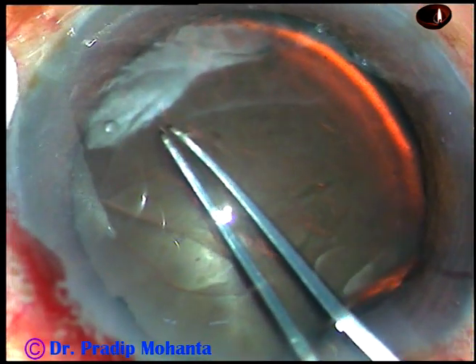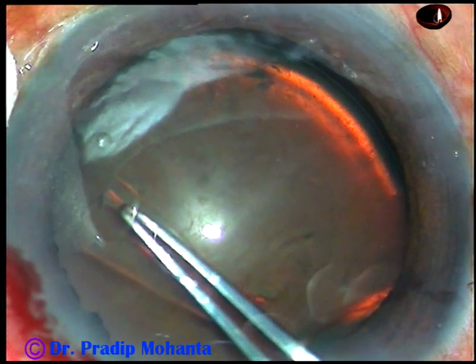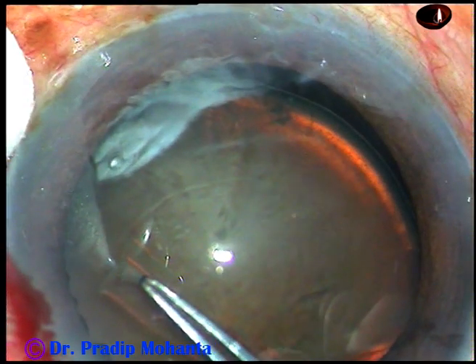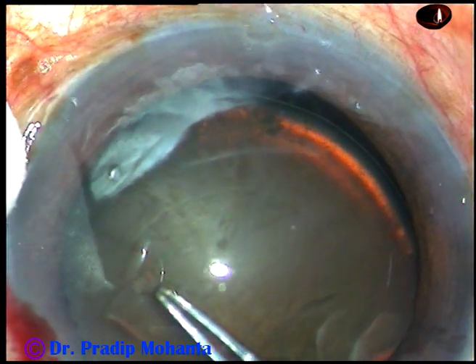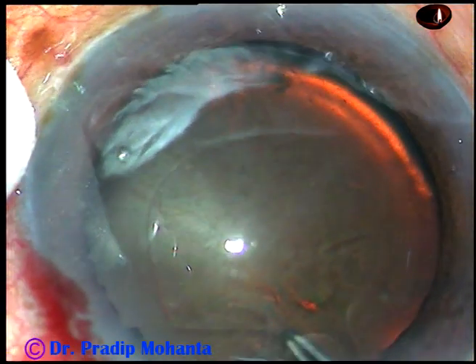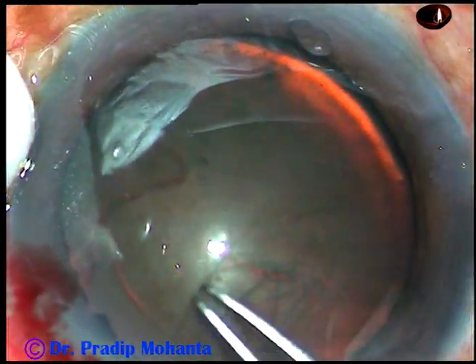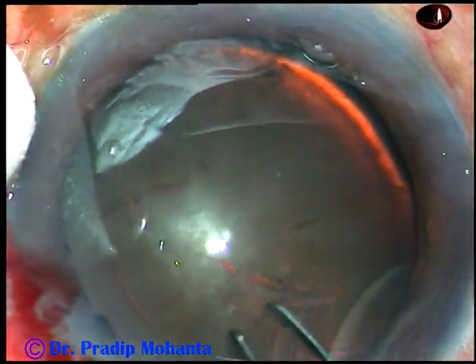In such cases, we should not pull the capsule in a jerky manner. In this view, we can see subluxation of the cataract inferiorly for a few clock hours. So I am very gentle in pulling the capsule, doing it very slowly and steadily.